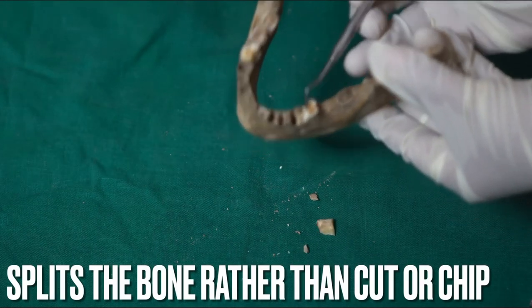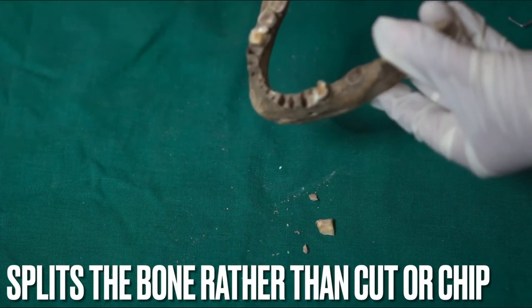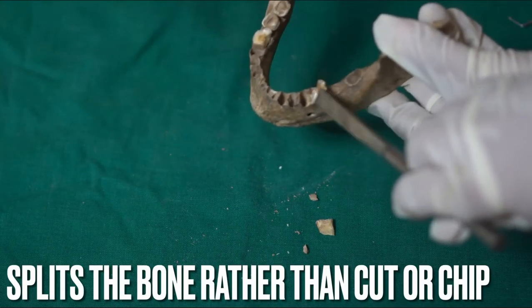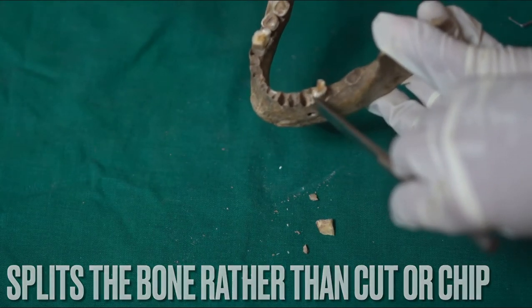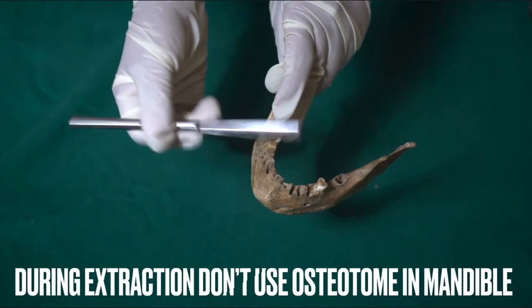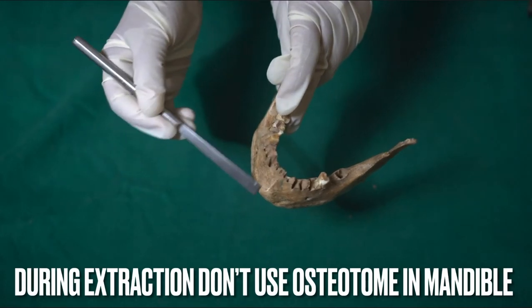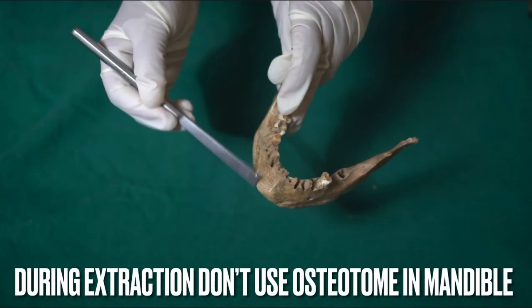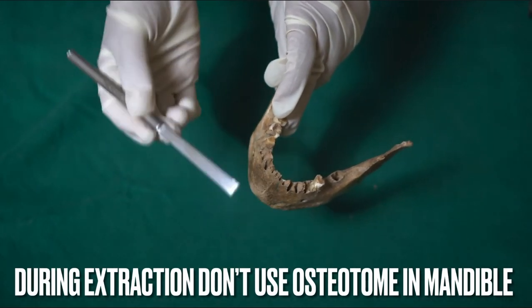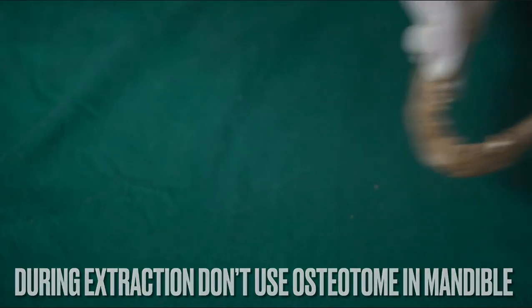As shown in the video, once it has split, we remove one part, making it much easier to complete the extraction. Important note: during extractions, do not use the osteotome on the bone area — only use it in the tooth or root region. If used on the bone itself, the osteotome could split the whole mandible.